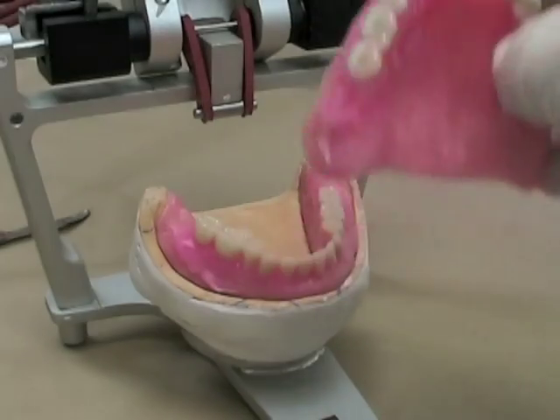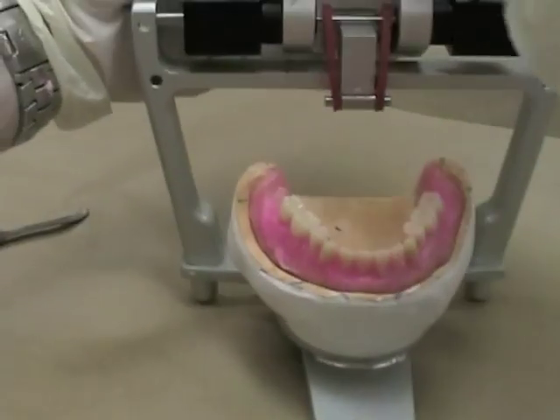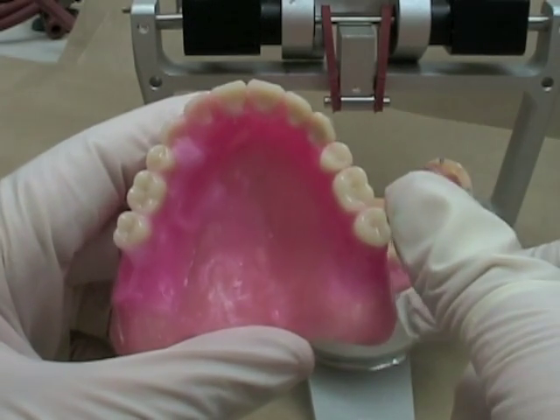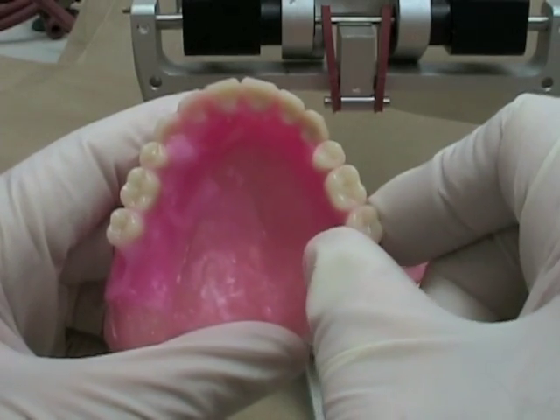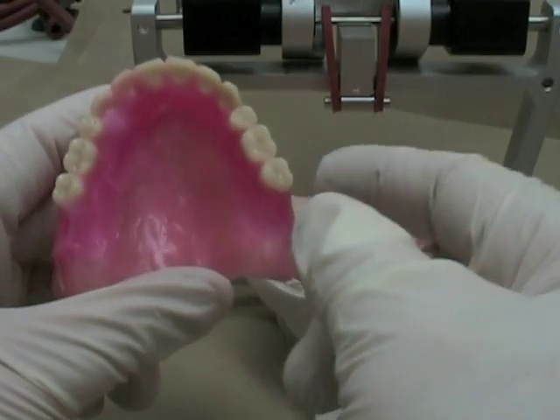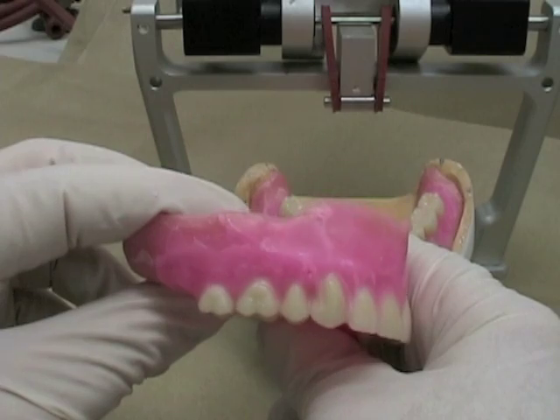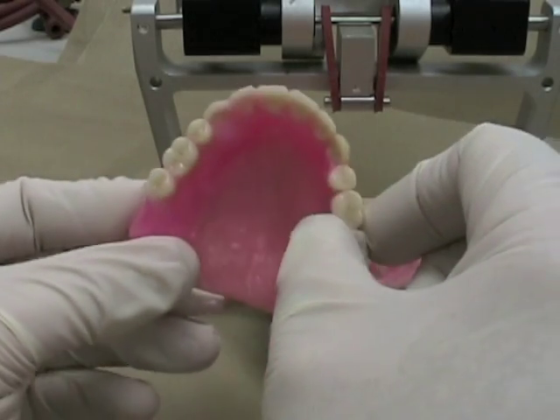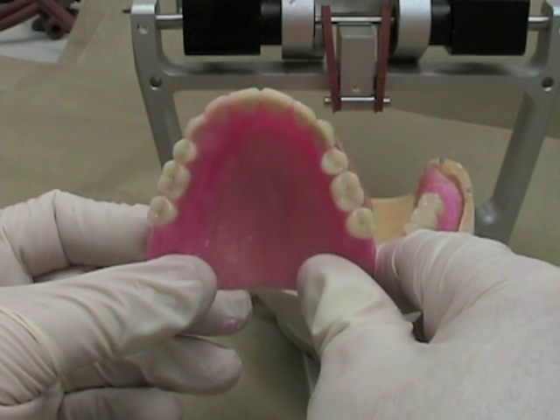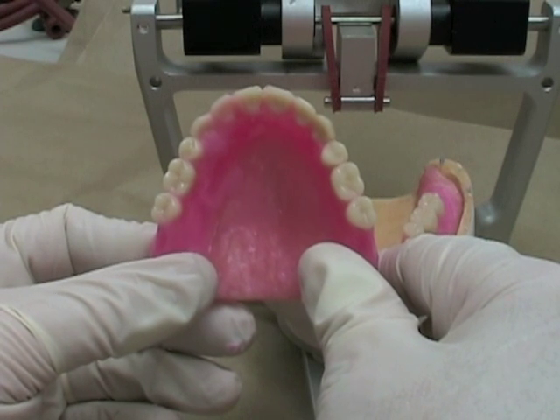A minimum of wax is probably better than trying to finish it off at this point, as you may still find that you have some changes to make in tooth position. When I look at my maxillary arch now I'm quite happy with the way I've set this. Looking at the other side, maybe the second molar — tooth 2-7 — may be a little bit too far buccal and I may need to change that, either bringing the mandibular teeth in or adjusting its position. But that's basically how we begin to set up the posterior teeth. You may have to make a few minor changes to the side that your technician has set. The next thing we're going to do is take a look at where those contacts are and make a few refinements of tooth position to make sure we can get the contacts we want throughout the arch.